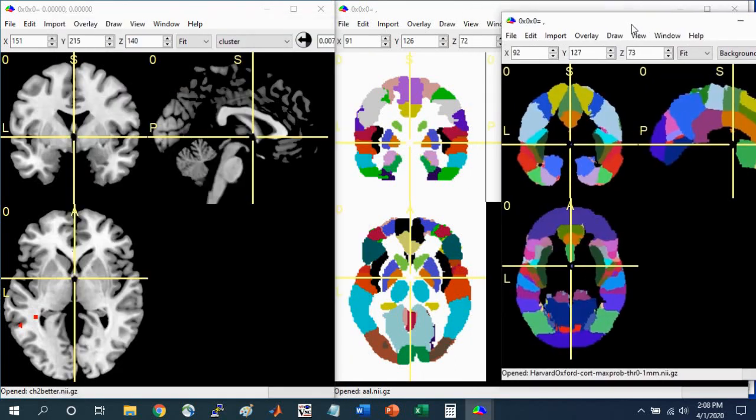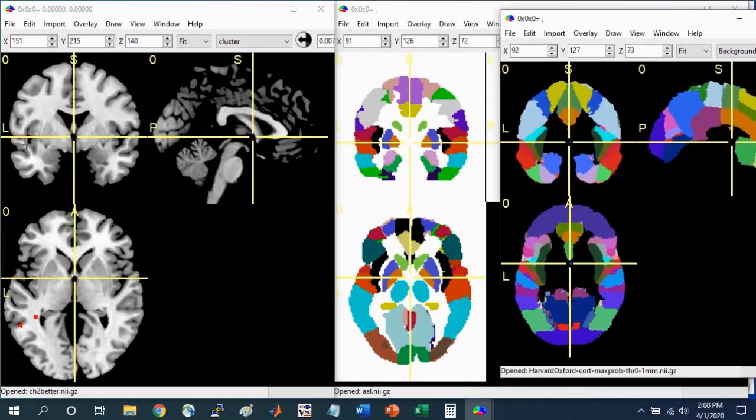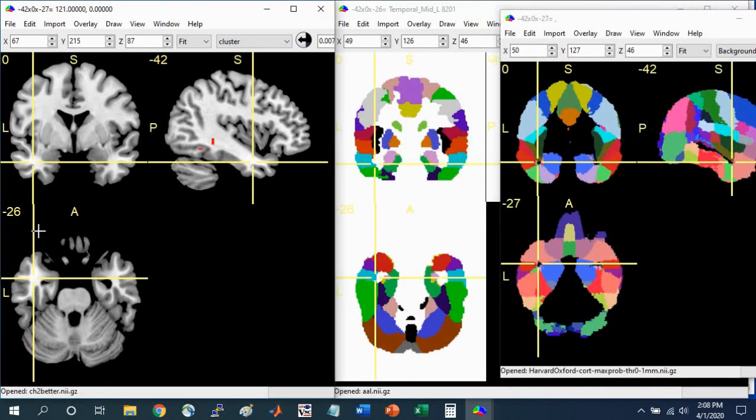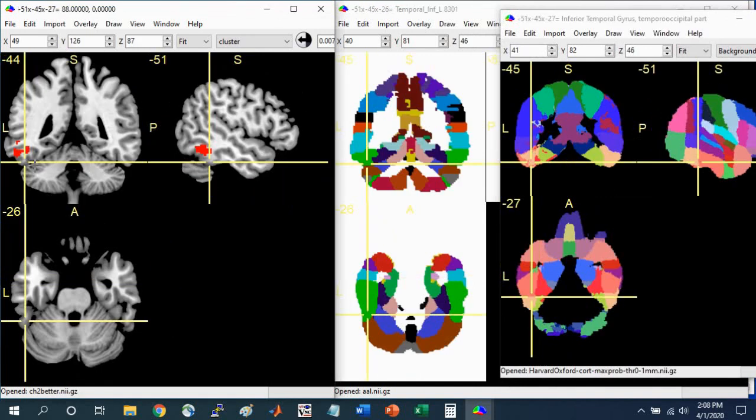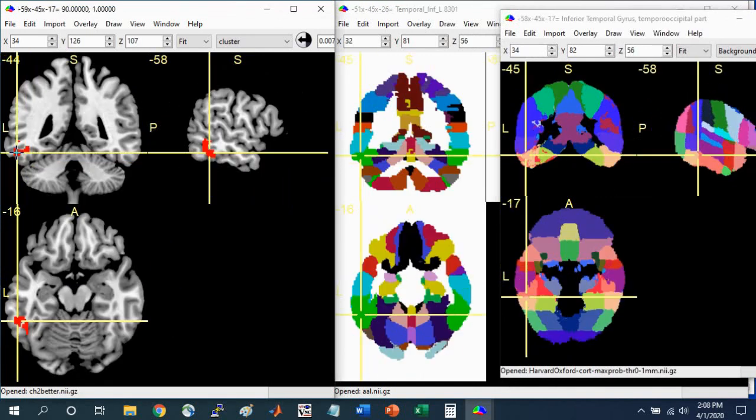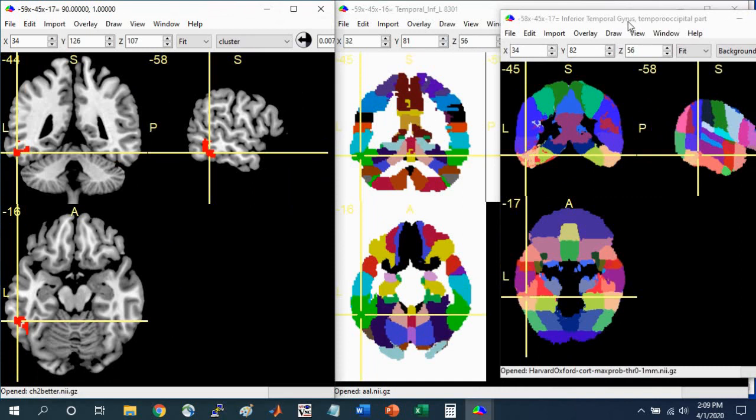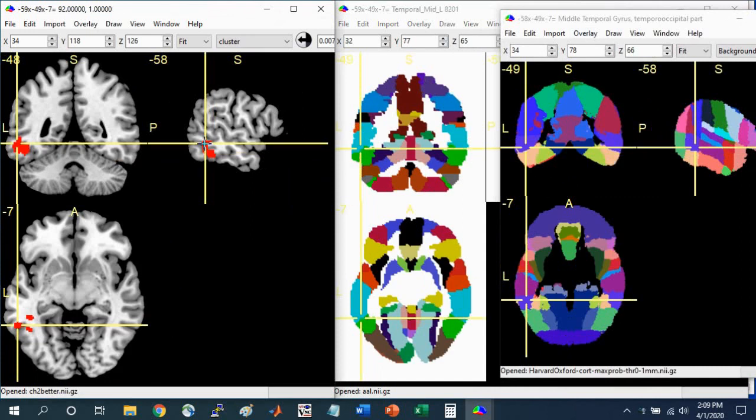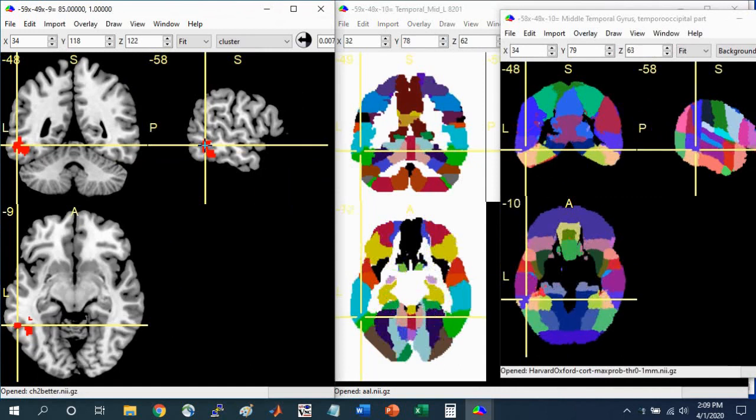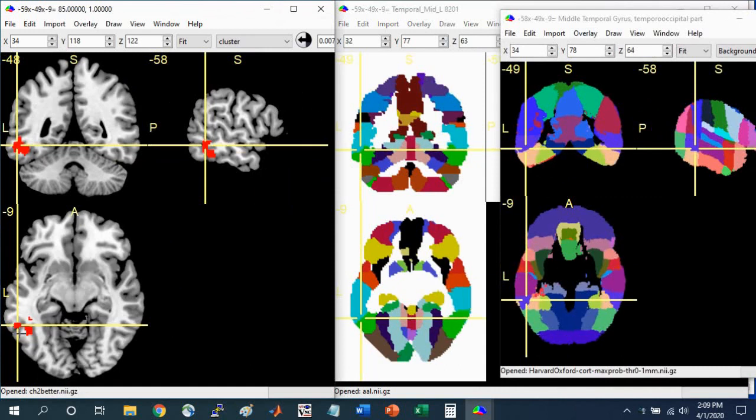Let's say I want to again navigate to this cluster. You can see how the region is defined in the AAL Atlas. Up here at the top, it's the left inferior temporal gyrus. In the Harvard-Oxford Atlas, the same coordinate is defined as the left inferior temporal gyrus, the temporal occipital part. Now you can click on different voxels of the cluster you're interested in and see what parts of the brain are associated with it. That's one way you can do it.